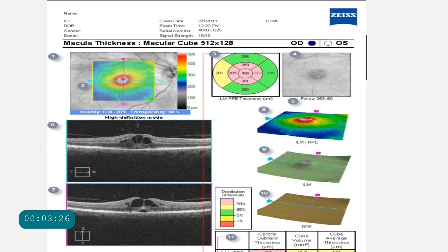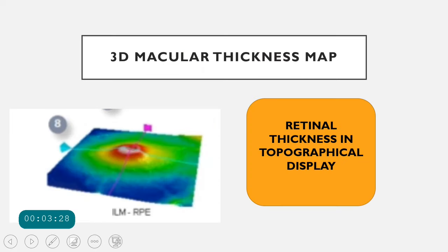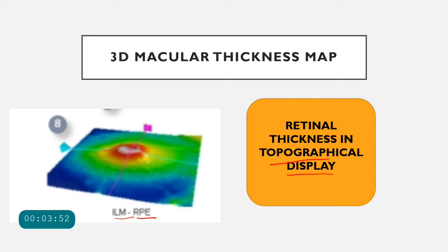Next is the 3D macular thickness map. This thickness map is calculated from the internal limiting membrane to the RPE, and the retinal thickness is depicted in a topographical display. Wherever there is greater thickness, it appears reddish in color; moderate elevations are in yellow; and thinner areas are represented in blue.